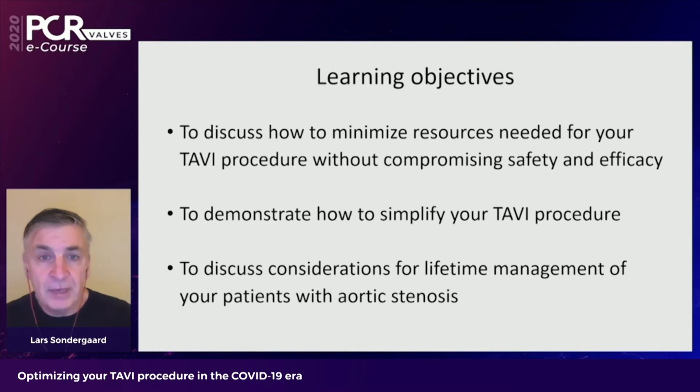So we all have faced a very difficult time during this year due to the COVID-19 situation. There's a very hard demand to try to simplify our procedures and limit the resources needed. And we're going to spend the next 60 minutes to discuss how to minimize resources needed for your TAVI procedure, of course, without compromising safety and efficacy, and also to demonstrate how to simplify your TAVI procedure.